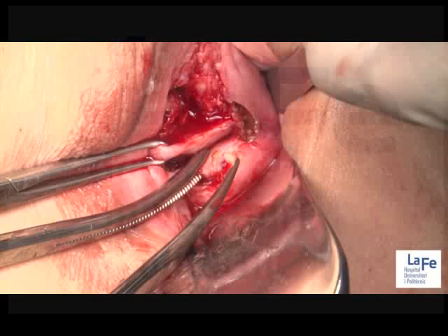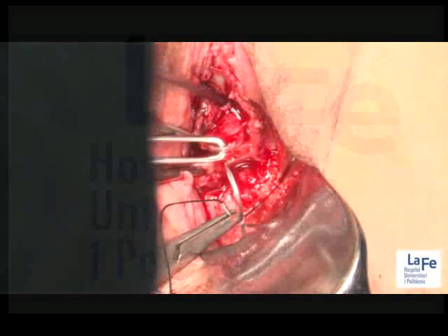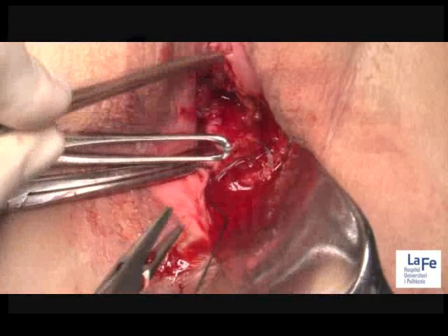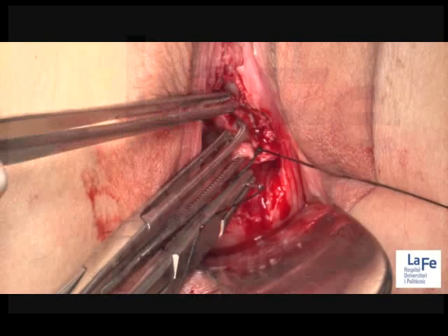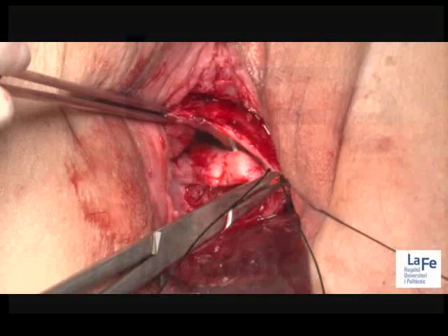Protective maneuvers, like early vaginal cuff closure, have been proposed in order to avoid any possibility of tumor manipulation or exposure to the pelvis during colpotomy by laparoscopy. After this point, radical hysterectomy can be completed laparoscopically and the surgical specimen can be removed without any tumor manipulation.